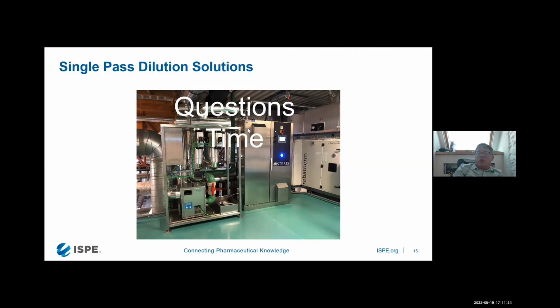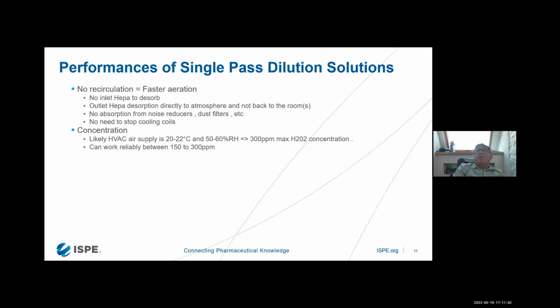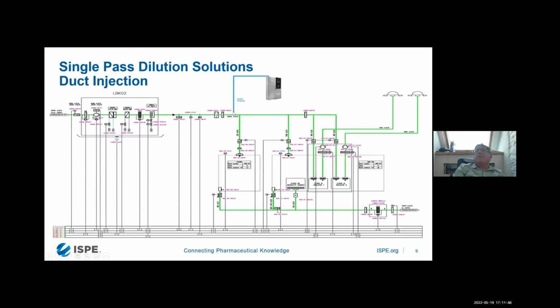And then as I showed before, this is diluted inside the ducting. So I take it as an example. So here we could have a few thousand ppm, but here the dilution will be instant. But yes, we can have a few thousand ppm. And as I said, the dew point will be something like 53, 55 C inside this pipe. So we need to guarantee we are not lower than this to not get any droplets of peroxide, which we don't want to happen.